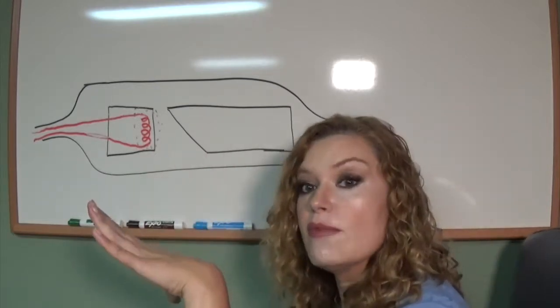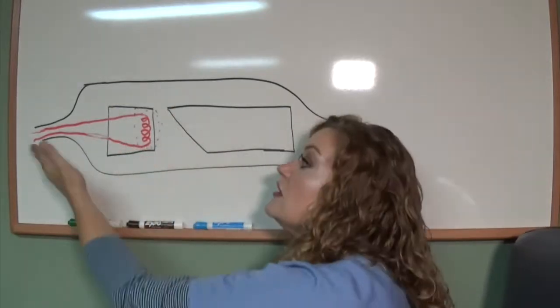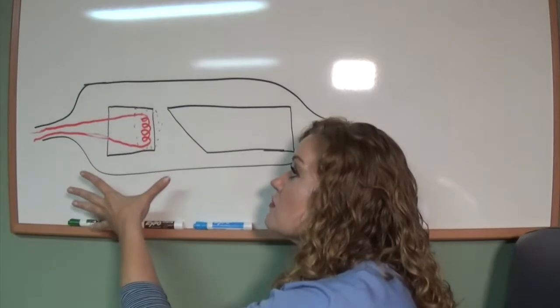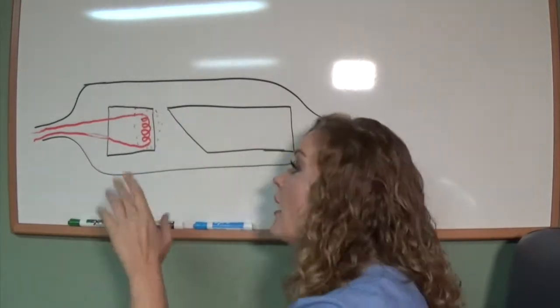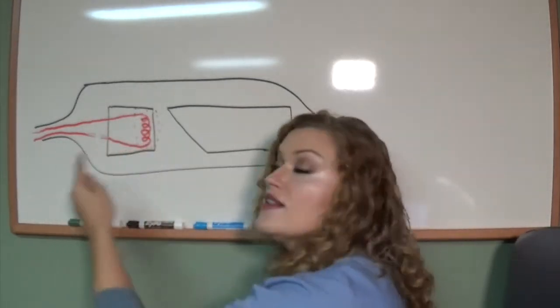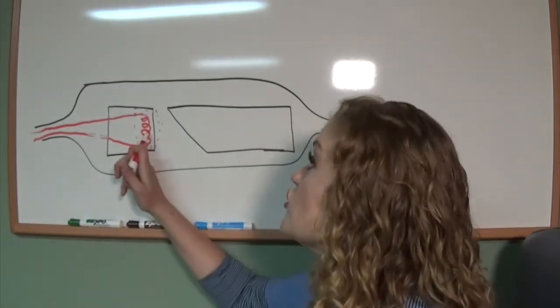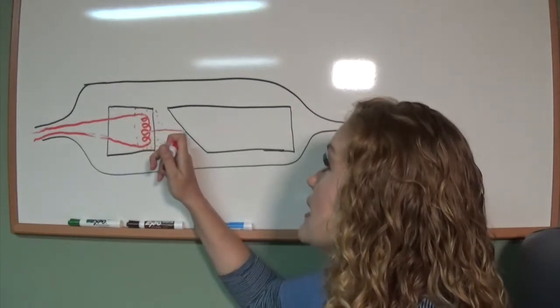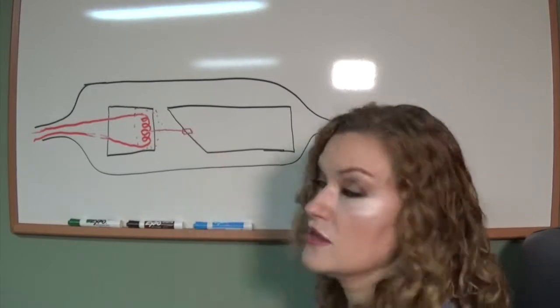Now, you're in standby mode. As you're in standby mode, you've got these electrons starting to fly around your wire and your tungsten filament, making this beautiful cloud. As soon as you actually depress the pedal all the way, you cut connection. So the electrons want to escape, but they can't. They don't know where to go. They don't know what's happening. So they come shooting across, electrons, electrons, electrons, and they hit the anode target.